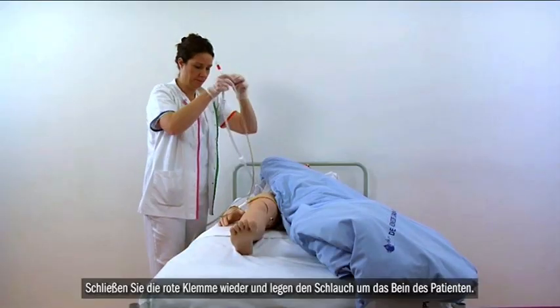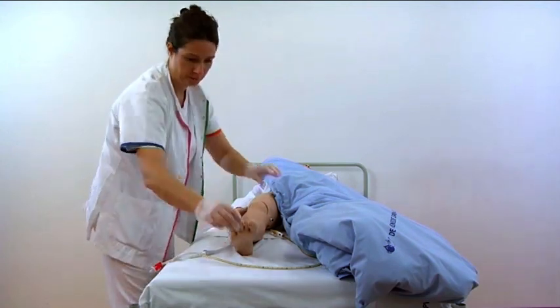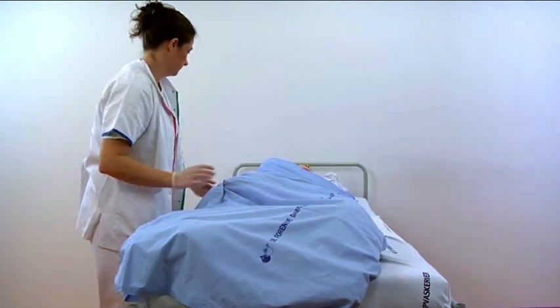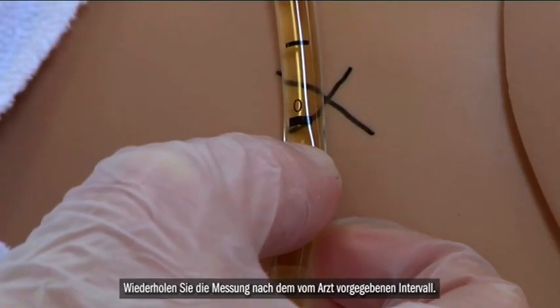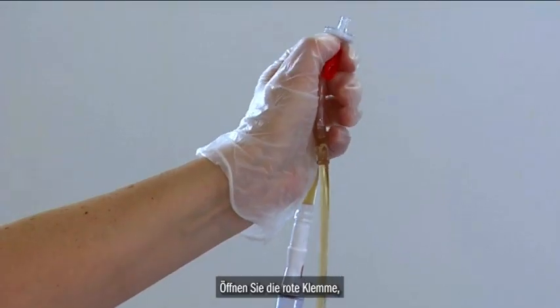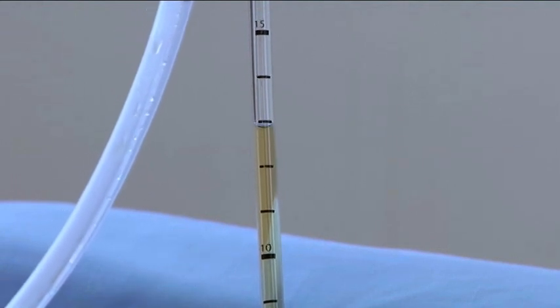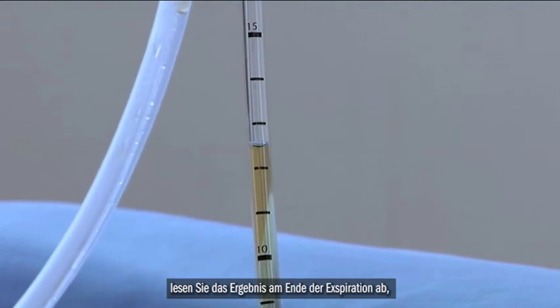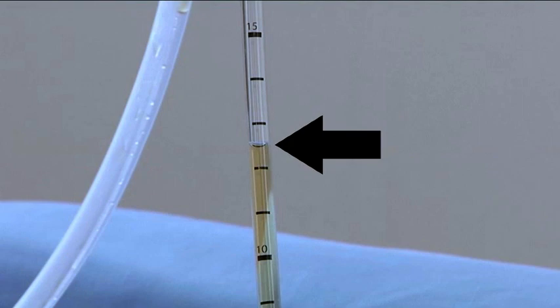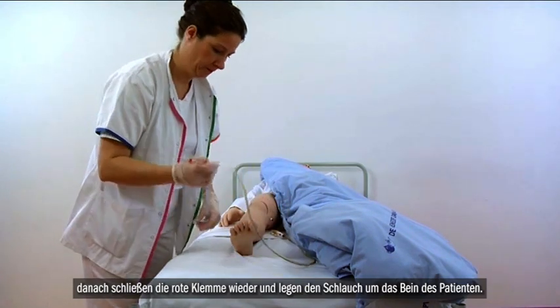Close the red clamp on the Unometer Abdo Pressure and place the tube around the leg of the patient. Repeat the measurement at the time interval prescribed by the doctor. Open the red clamp. Close the red clamp on the Unometer Abdo Pressure and place the tube around the leg of the patient.